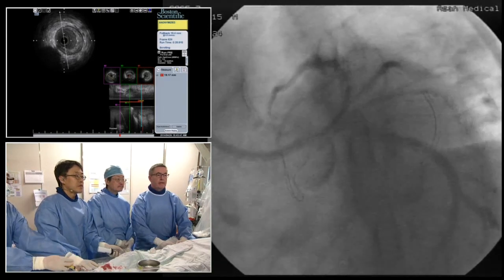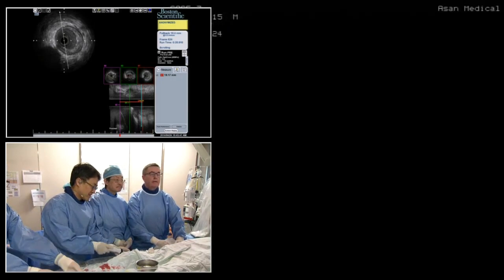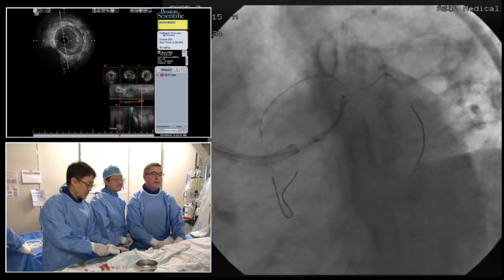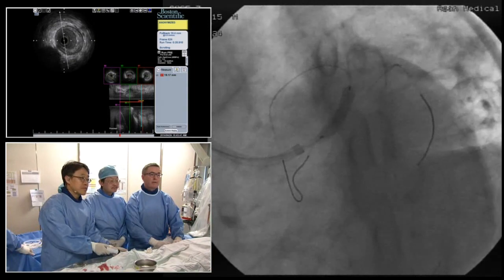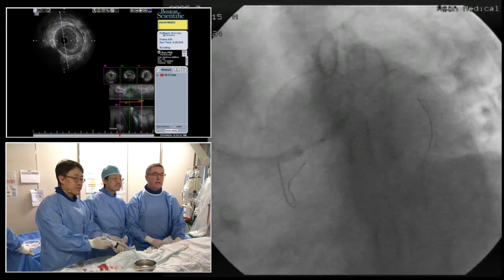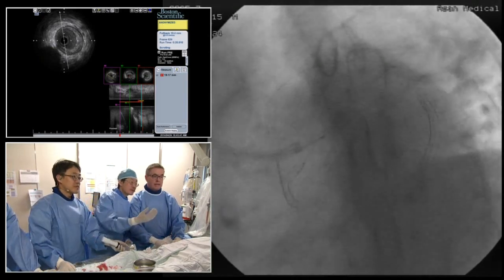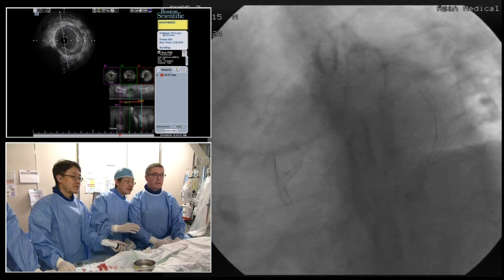I think that's fine. This left main also tends to be a little bit cone-shaped, so when you get towards the ostium, it's a 5.0 vessel. Yeah, that's so right. I think the way Ian has it is perfect. We also underestimate a little bit where the circumflex really starts angiographically, because you see where the wire starts to split. That's right, in the funnel of the left main trunk, so it's perfect.